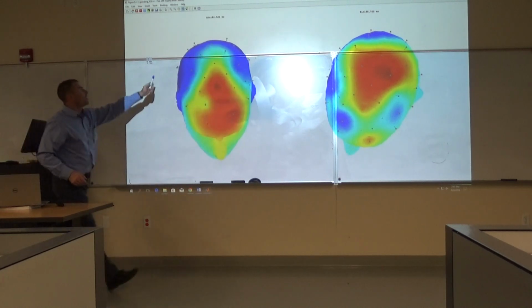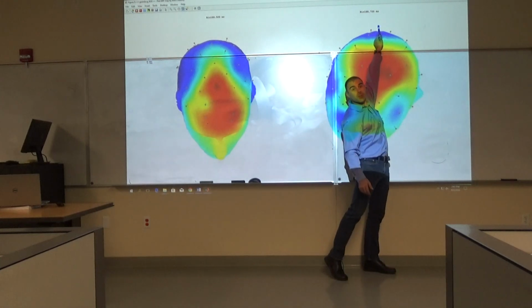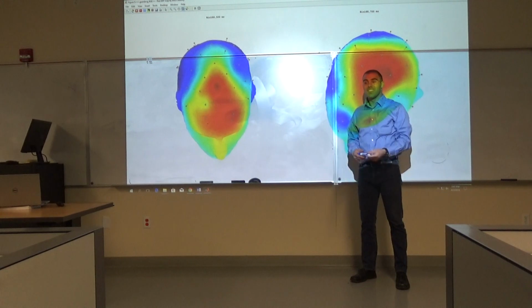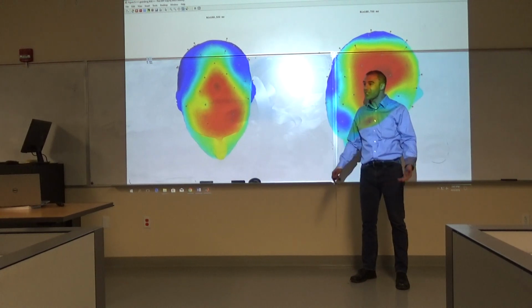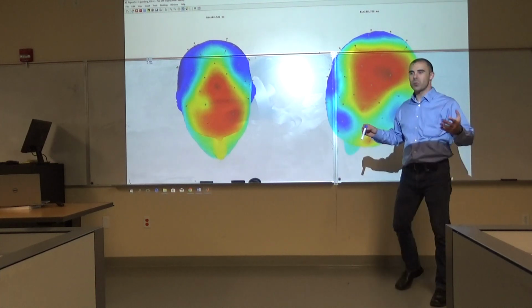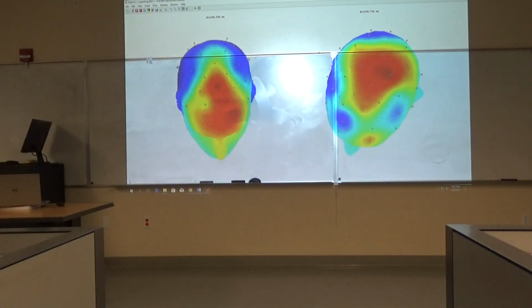Now here's what it shows. This is at 500 milliseconds. This is 200 milliseconds later at 700 milliseconds. That's pretty cool. I never knew that before. I just learned something new. And you can make some cool pictures and save them, or do whatever. Pretty cool. Like it, sir?